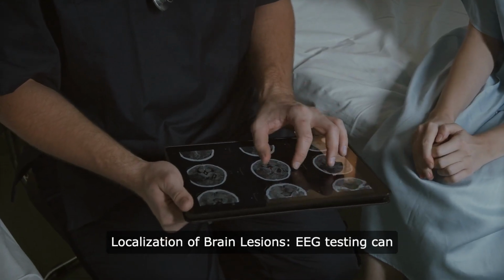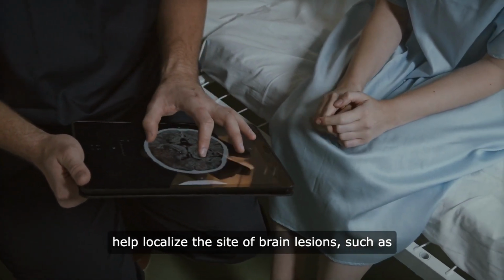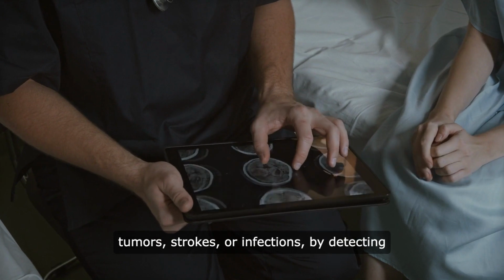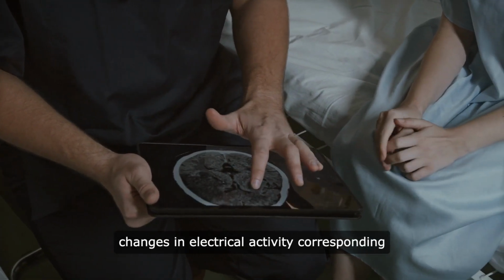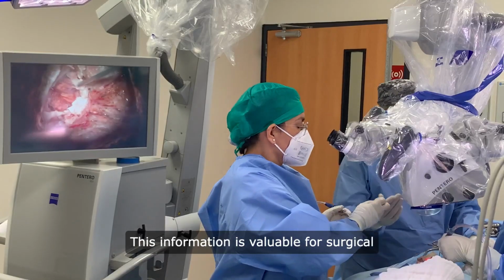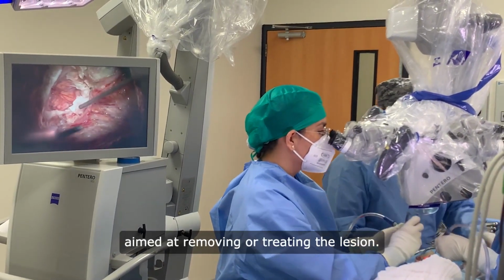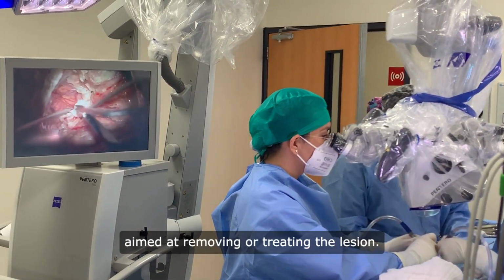Localization of brain lesions. EEG testing can help localize the site of brain lesions, such as tumors, strokes, or infections, by detecting changes in electrical activity corresponding to the affected brain regions. This information is valuable for surgical planning and guiding interventions aimed at removing or treating the lesion.